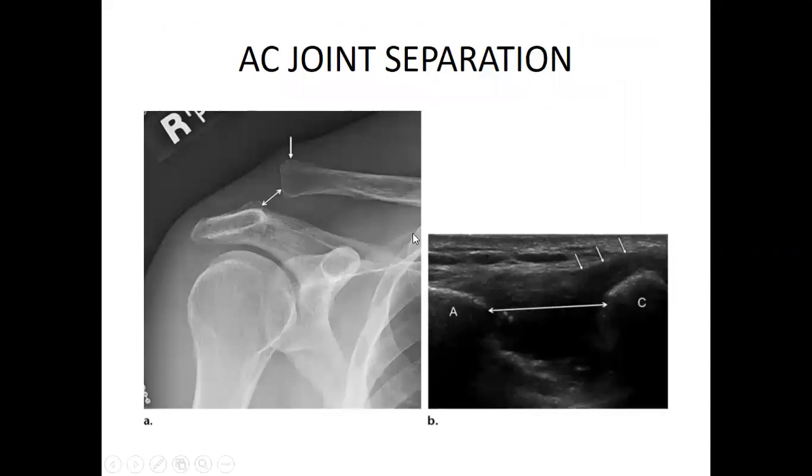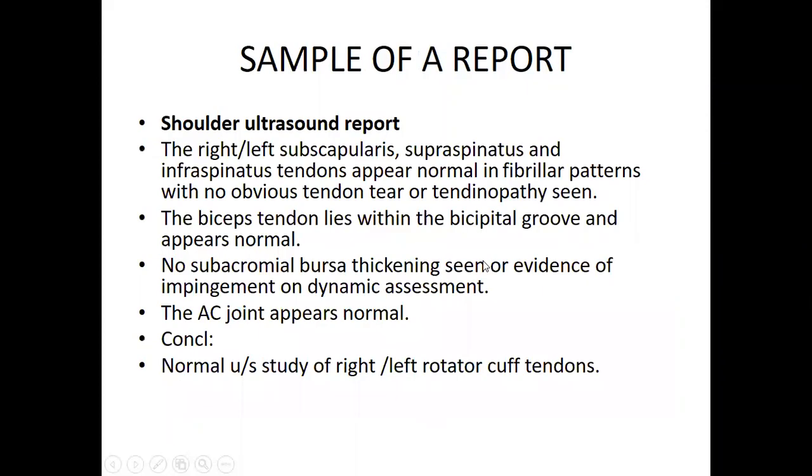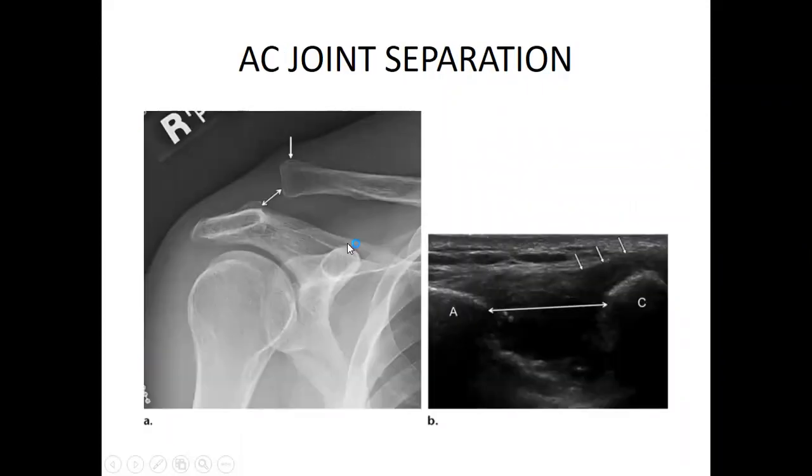Here, I was just trying to demonstrate acromioclavicular joint separation. You have to be aware of the normal anatomical appearance of the acromioclavicular joint, even on X-ray.